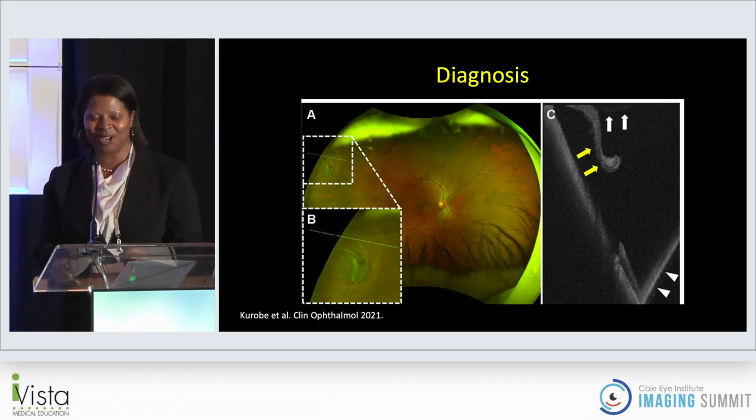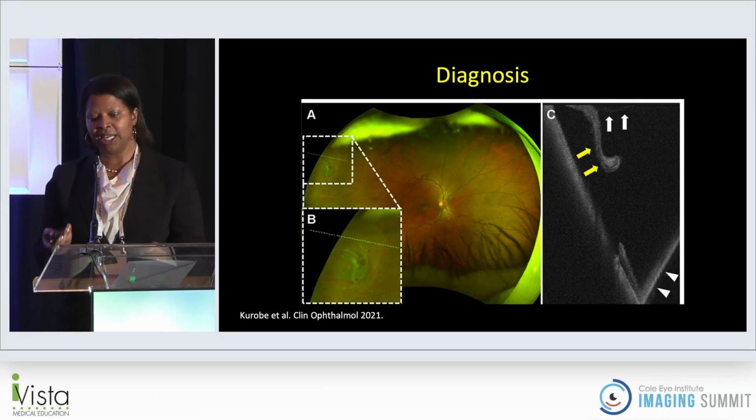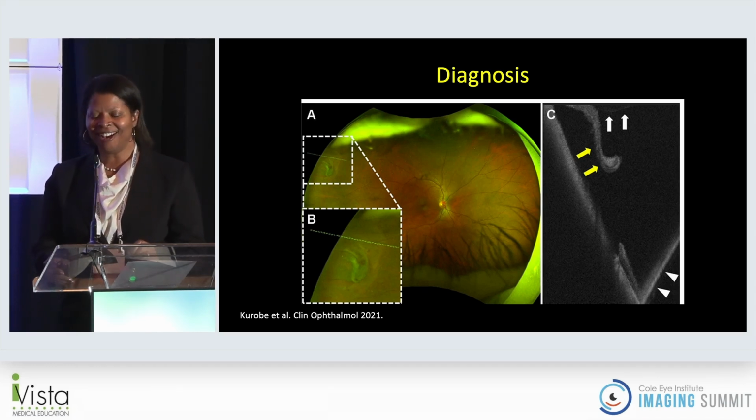We had a lovely talk by Vas Sara about lattice degeneration. Who knew lattice was the exciting topic of the night? But you can see a retinal break there, and you can see a very nice image there. Not only can you see it on ultra-wide field fundus photograph, but, in all disclosure, this is challenging. So you can't just go to the photographer and be like, hey, take this peripheral break photo, and it requires quite a bit of expertise and some patient cooperation as well. We can just see this person definitely has subretinal fluid and a retinal break there.